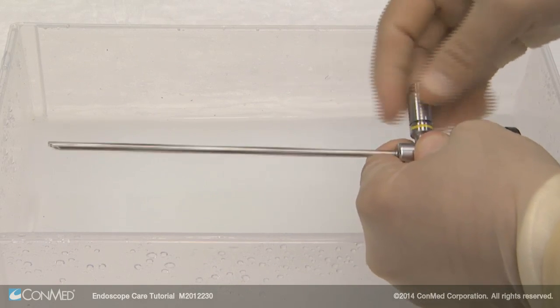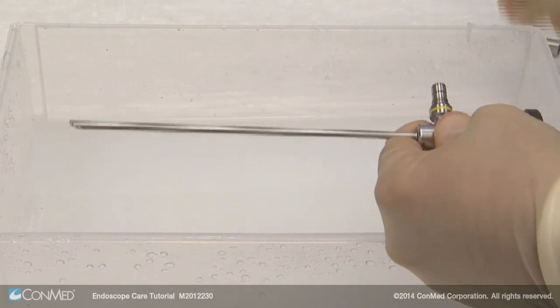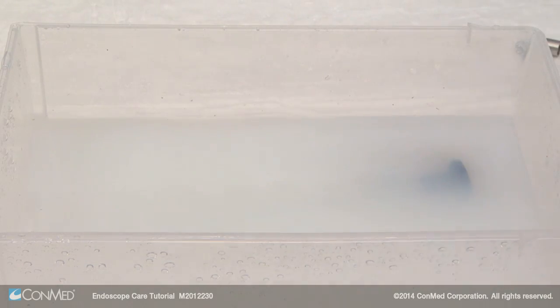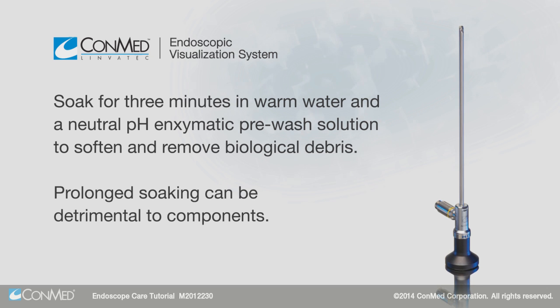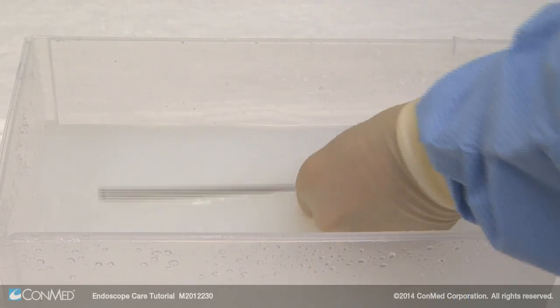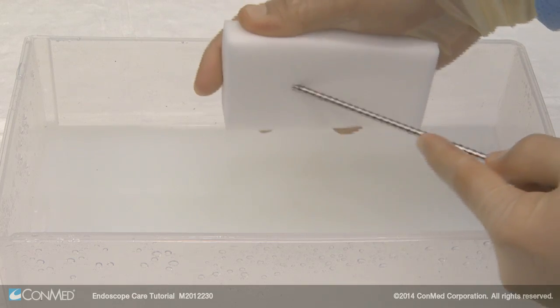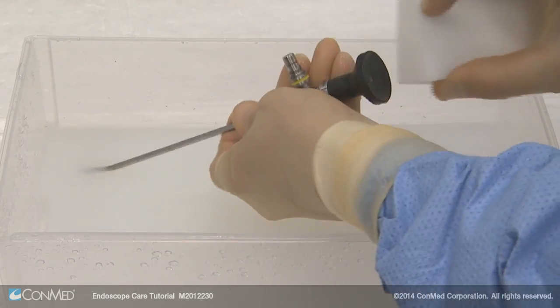The first step in the cleaning process is pre-rinsing. Start by disassembling all components, including fiber optic post adapters. Using a tray designed for endoscopes, soak for three minutes in warm water and a neutral pH enzymatic pre-wash solution to soften and remove biological debris. Prolonged soaking can be detrimental to components. Washing can occur with an appropriate neutral pH detergent. Carefully clean with a soft bristled brush or sponge only, taking care not to damage optical surfaces.